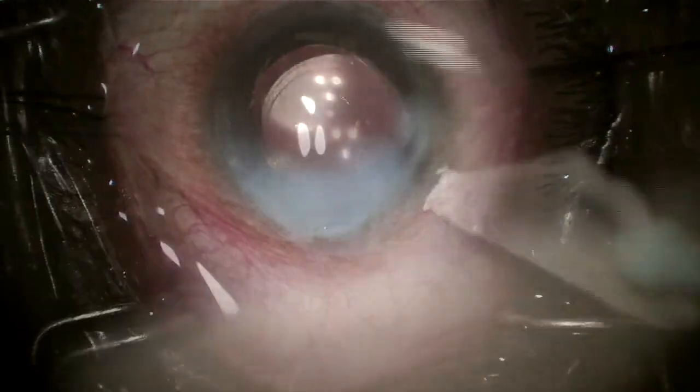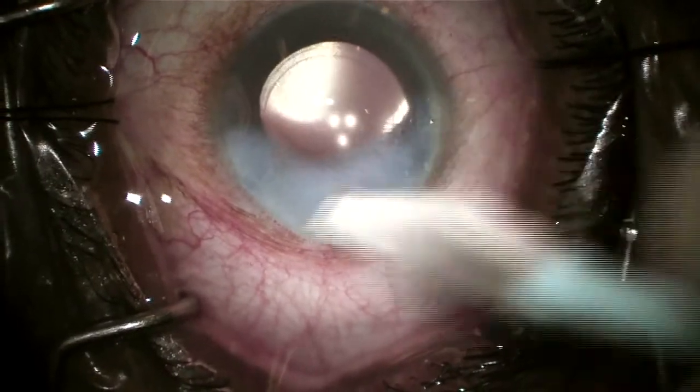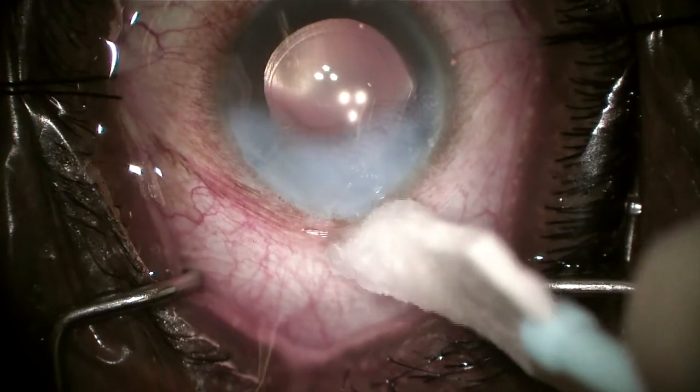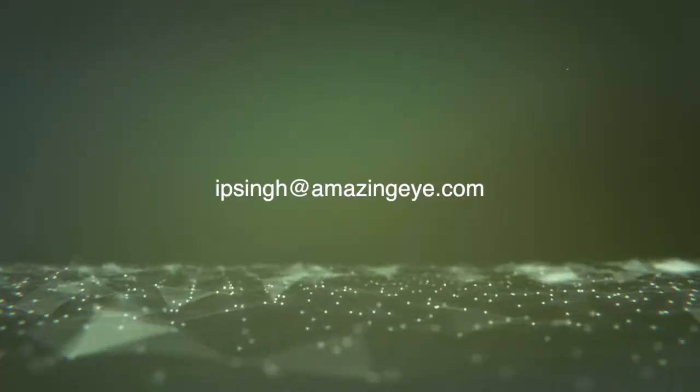At the end of the case I like to over-inflate it and then slowly burp the wound to make sure there's no reflux of blood and to burp it to make sure we have physiologic pressure — and we are now done with the case. Please email me anytime if you have any comments or questions. Thanks a lot.